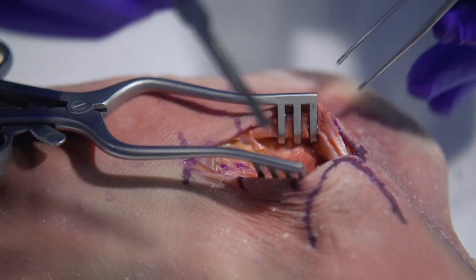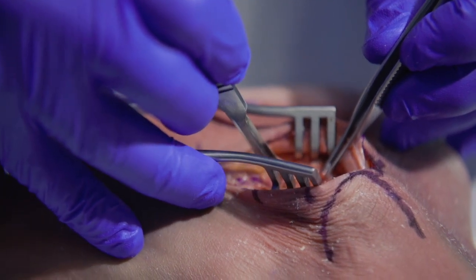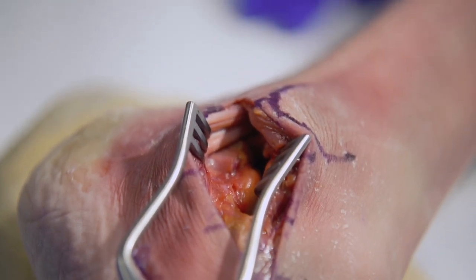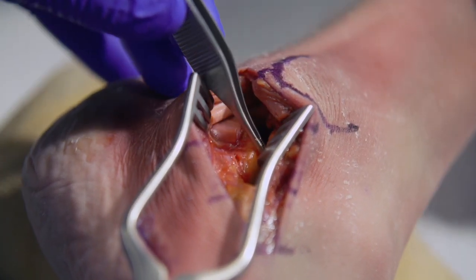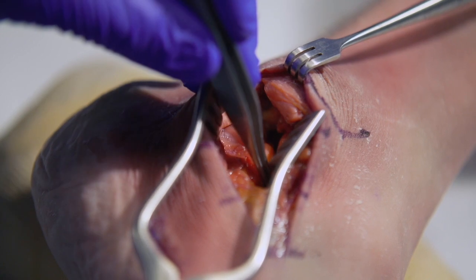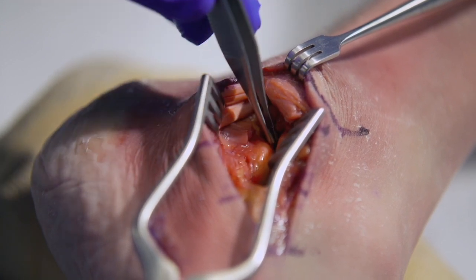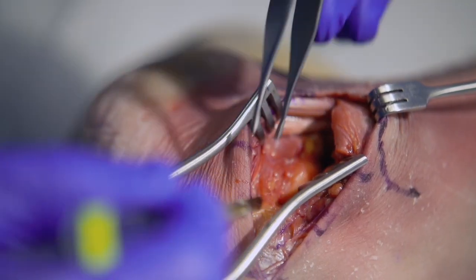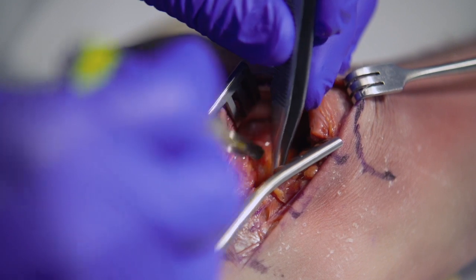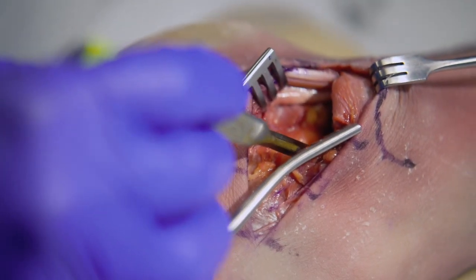With all vital structures retracted out of the way, lateral arthrotomy to the posterior facet of the subtalar joint is easily obtained, extending onto the sinus tarsi and over the anterior calcaneus. The peroneal tendons are retracted and you can see a significant amount of the posterior facet. Additional dissection over the anterior aspects of the calcaneus is sometimes necessary to visualize the middle facet of the subtalar joint. Dissect along the floor of the sinus tarsi, facilitated once you place a laminar spreader in between the posterior facet.